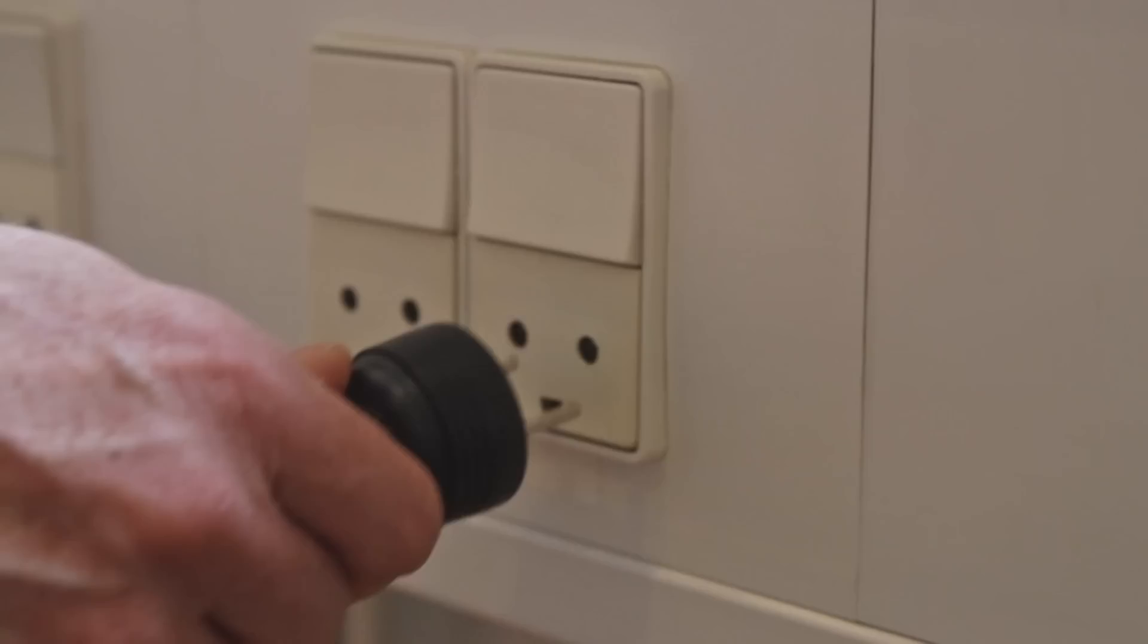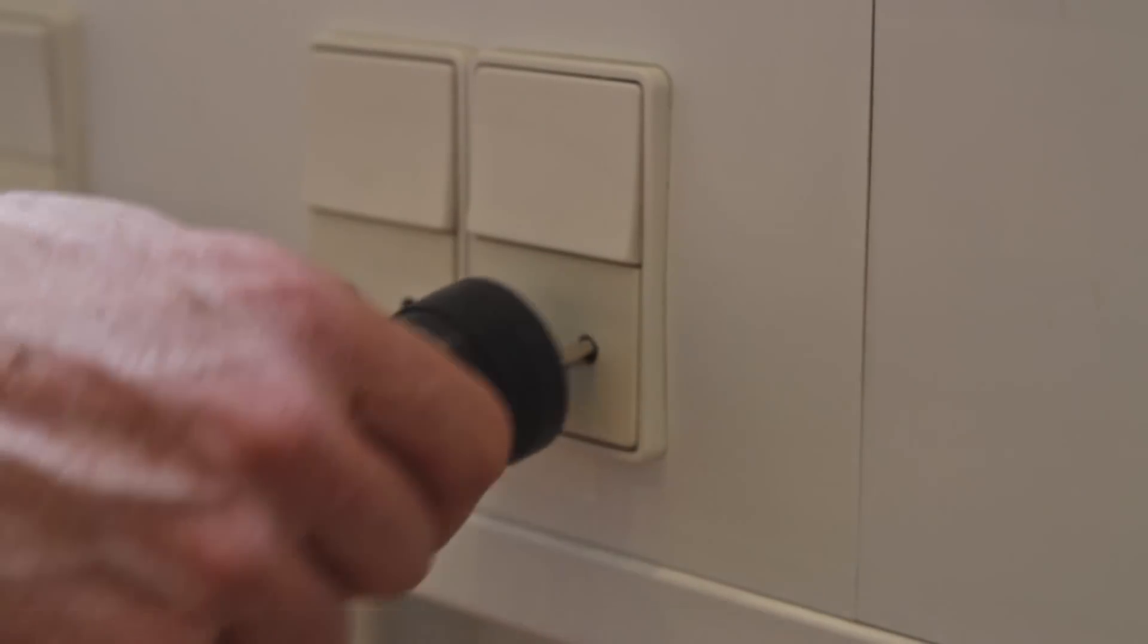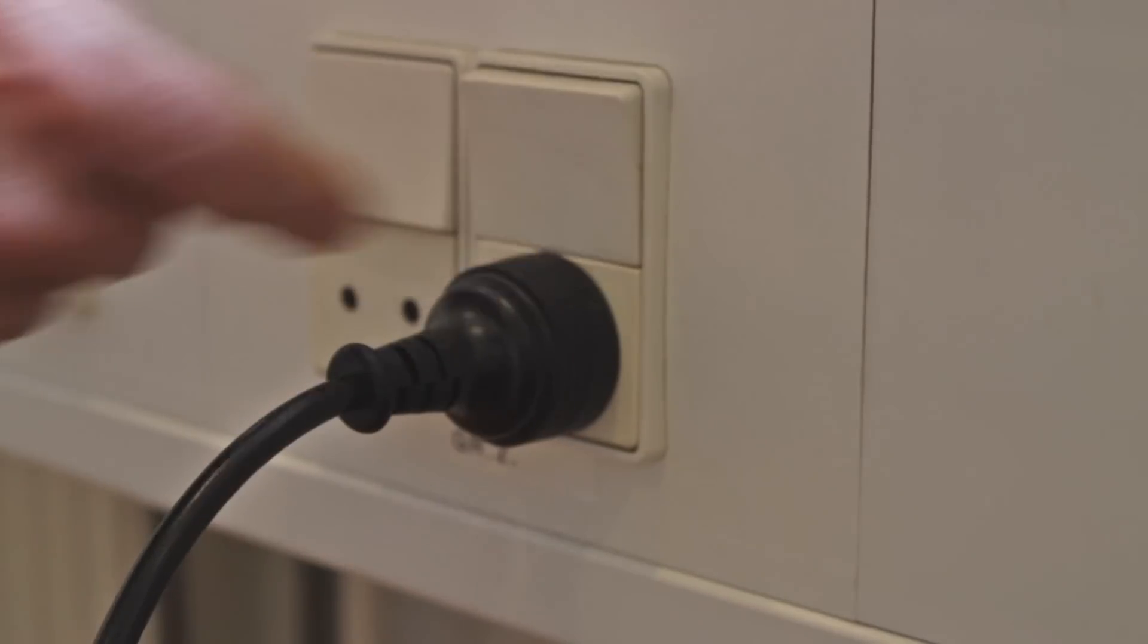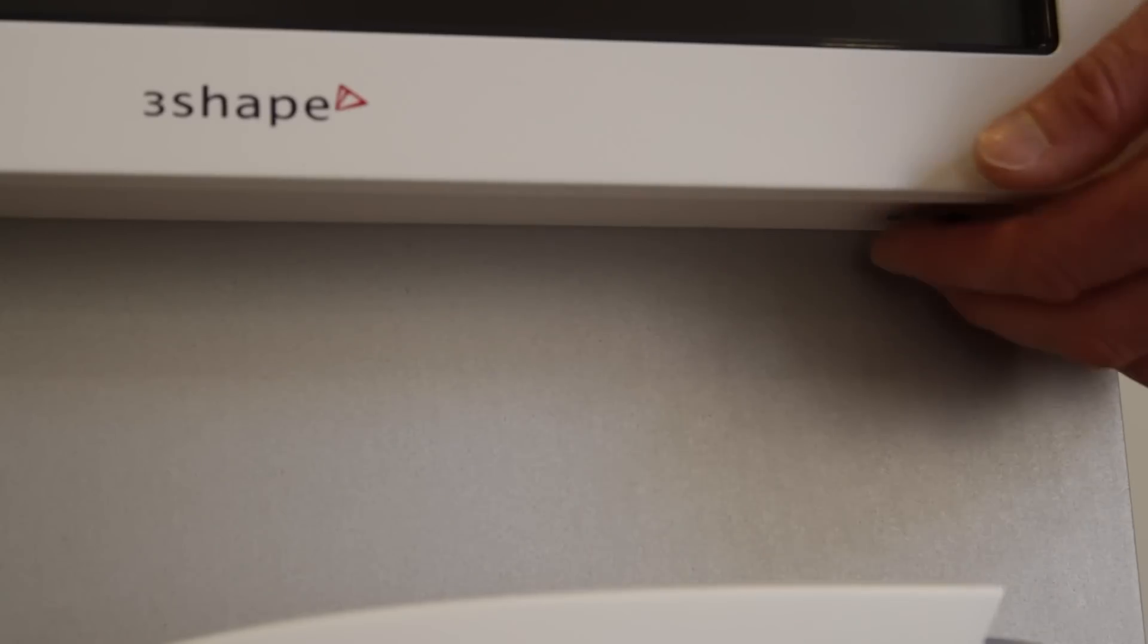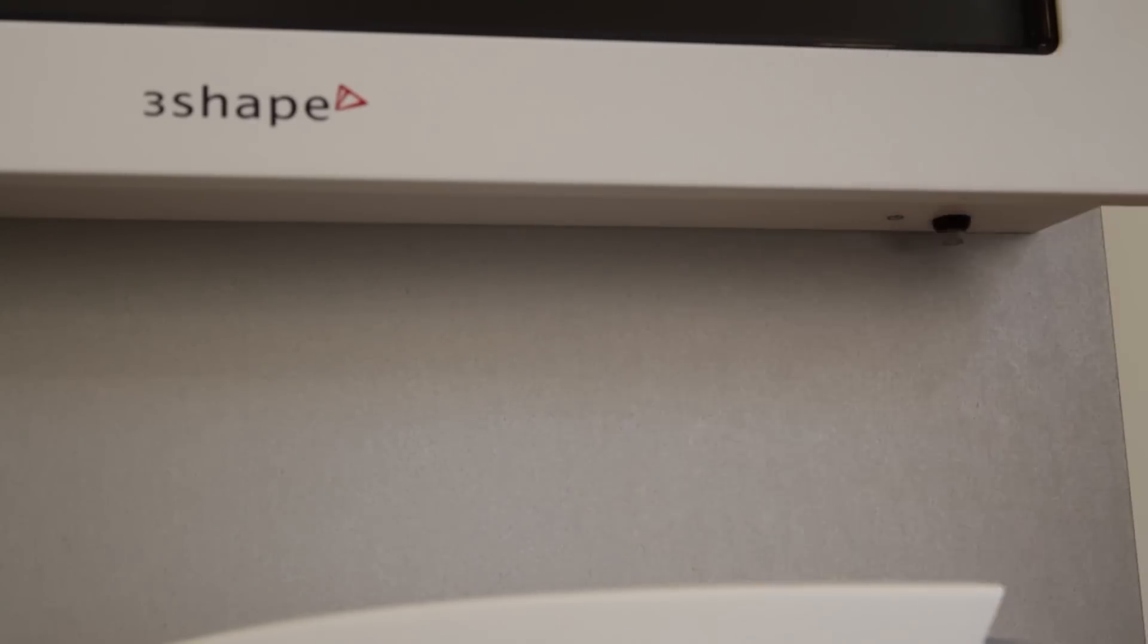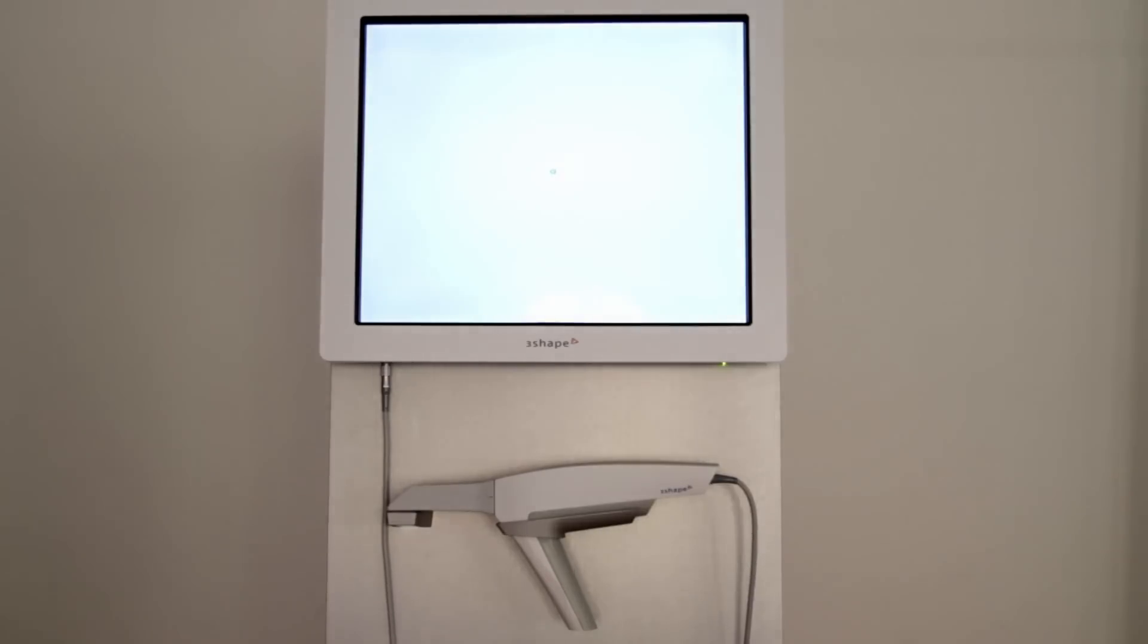Connect the power cable to the cart and a wall socket. Turn the system on by pressing the green button underneath the right corner of the screen.